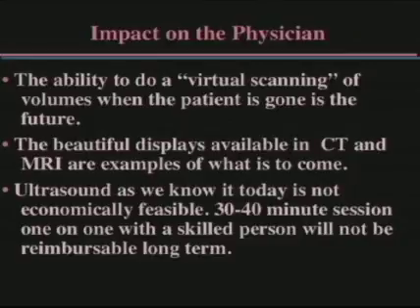And the impact on the physician, well, we'll have some beautiful displays, very similar to CT and MR, because ultrasound is now able to provide some of these large volumes that CT and MR enjoys. And really, ultrasound as we know it today is not going to be economically feasible long term. A 30 to 40-minute session to do a full structural survey one-on-one with a skilled person cannot be reimbursable or cost-effective for long.